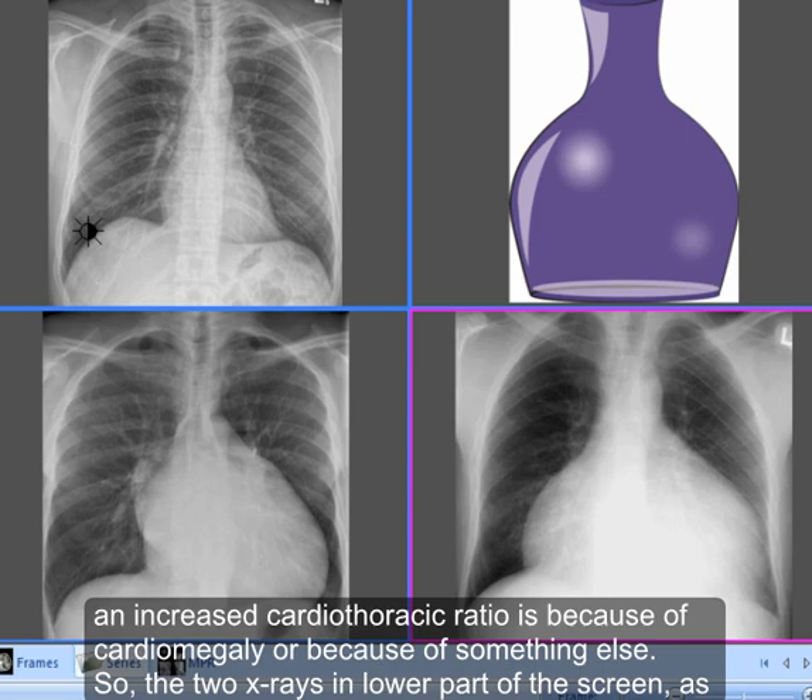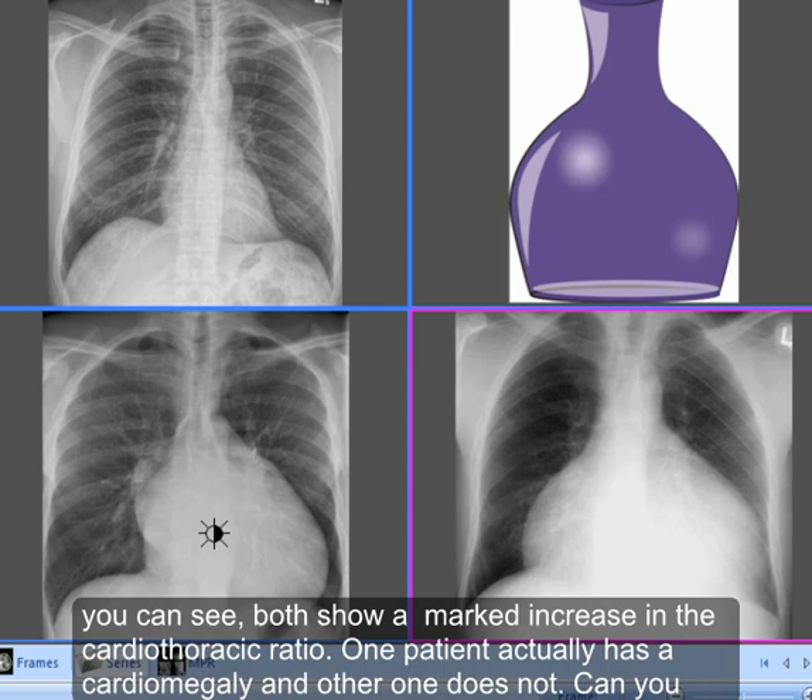The two X-rays in the lower part of the screen both show a marked increase in the cardiothoracic ratio. One patient actually has cardiomegaly and the other one does not. Can you tell which one does not have cardiomegaly?